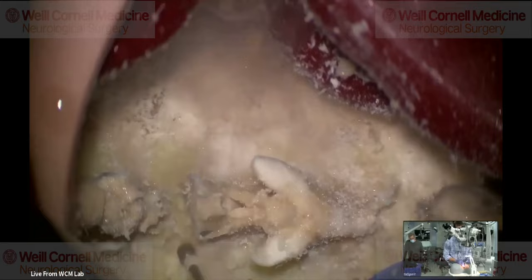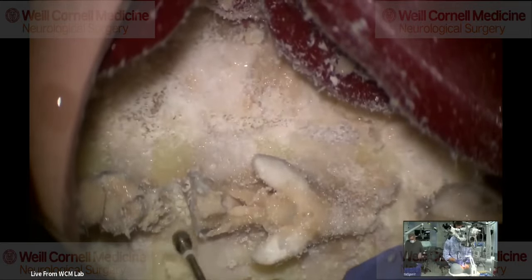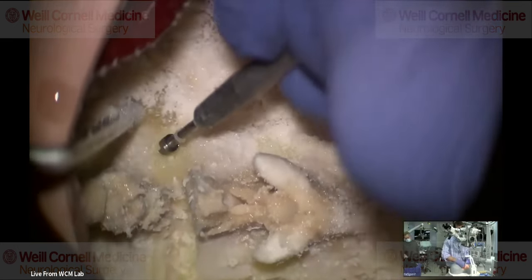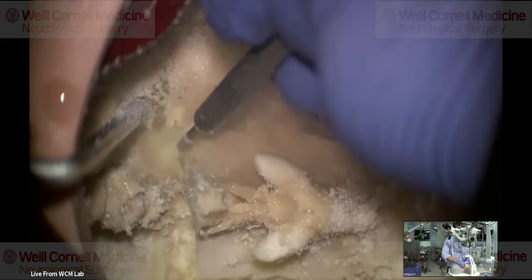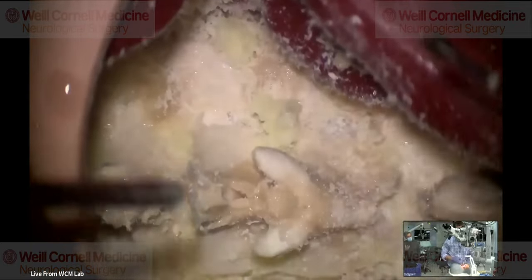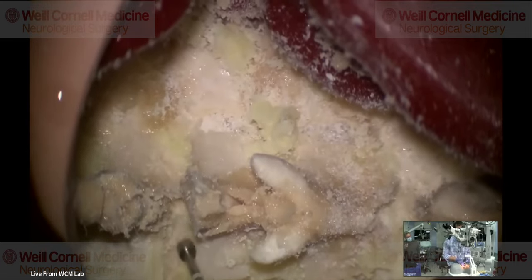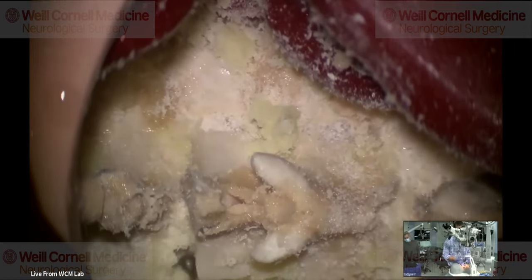Let me ask you a question now. I found that if I do all this work and I leave the ligament intact, and let's say I take the ligament at the very end after I lift up the bone, then during that process the amount of manipulation you have to use is much greater, and then sometimes I break the other side. Therefore, I take the ligament before I lift up the bone. Right, exactly. You have to, because this ligament will prevent you from lifting it up.